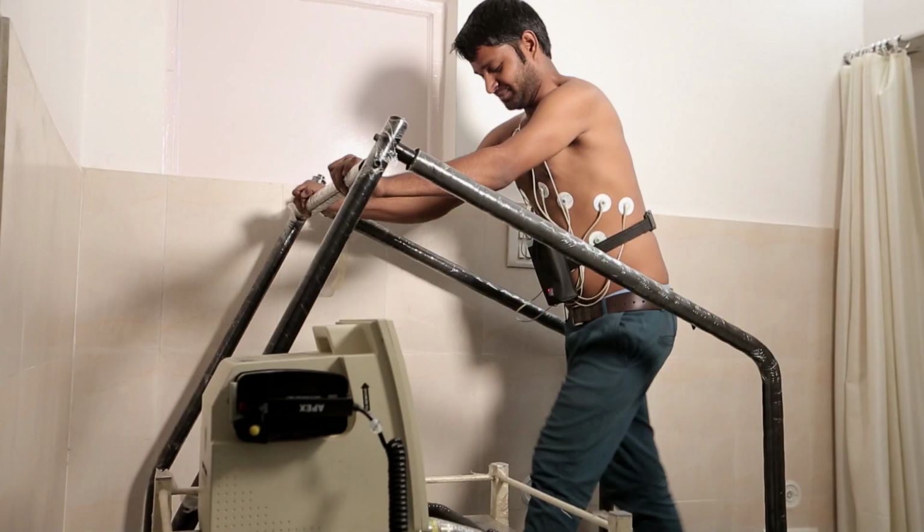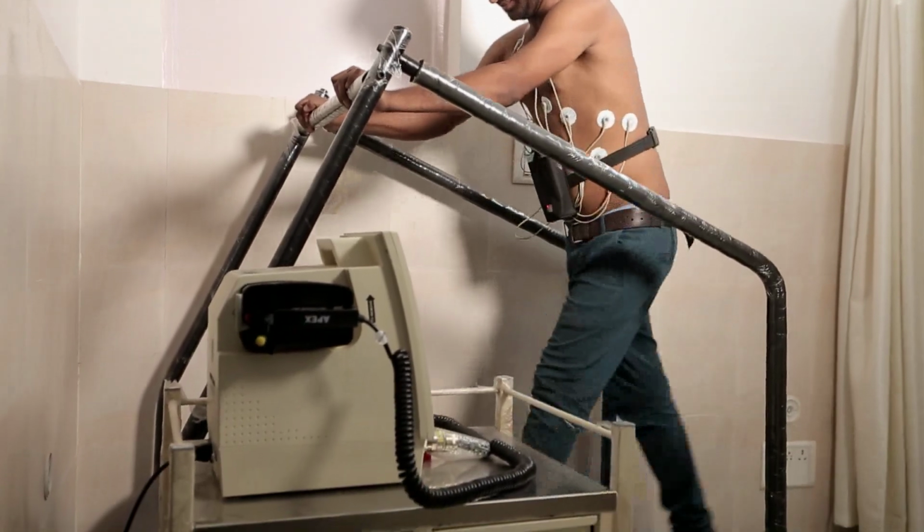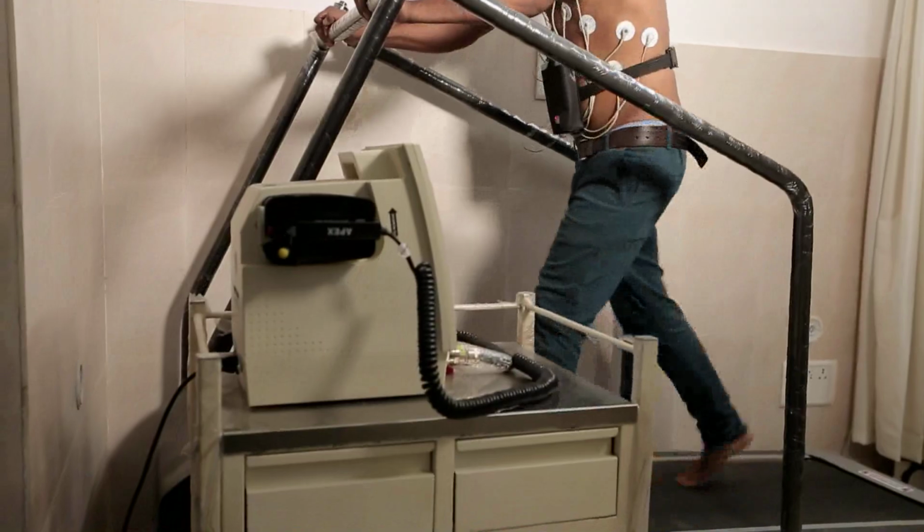Now both of these procedures are very simple procedures. They are non-invasive, they are absolutely painless. The only thing that is done is that some ECG leads are connected onto the chest wall, and the patient is made to walk on a treadmill machine. It is not even running, it is walking. Most of the times the test is over within 6 to 7 minutes. Sometimes it can go up to 8 to 10 minutes. The overall process may take a complete time of 10 to 15 minutes.